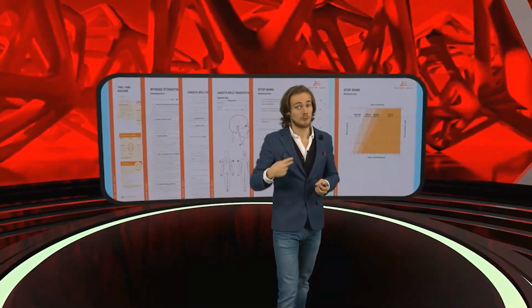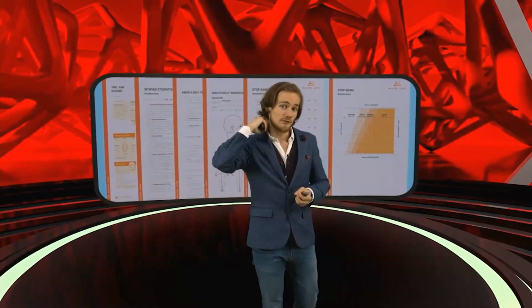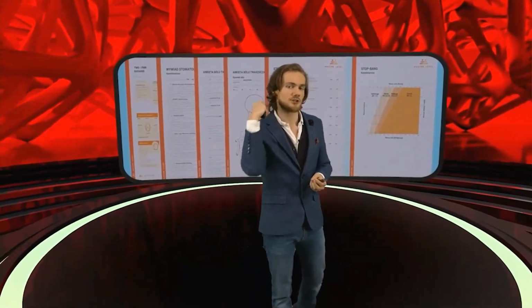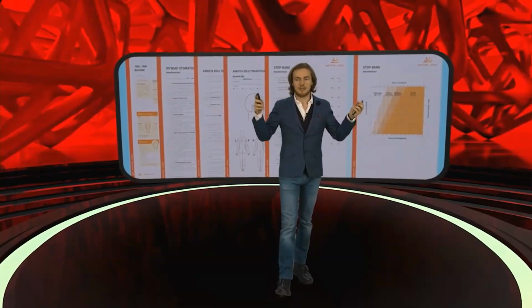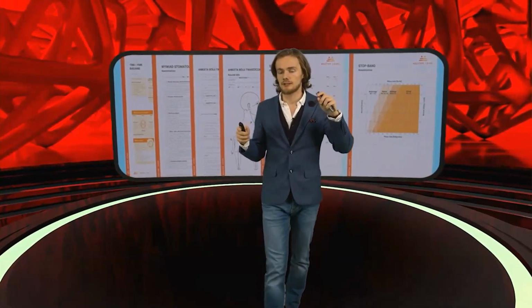Remember that when we are increasing VDO, it is like a scissors. So the cervical vertebrae is compressed and the airway is restricted even more. So diagnose it first, if you don't want to make your patient worse.